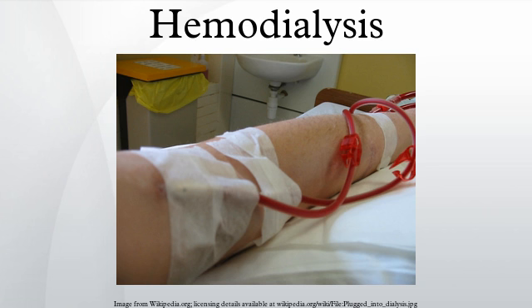If the pressure is removed prematurely or a patient engages in physical activity too soon after dialysis, the needle holes can open up. To prevent damage to the fistula and aneurysm or pseudoaneurysm formation, it is recommended that the needle be inserted at different points in a rotating fashion. Another approach is to cannulate the fistula with a blunted needle, in exactly the same place. This is called a buttonhole approach. Often 2 or 3 buttonhole places are available on a given fistula. This also can prolong fistula life and help prevent damage to the fistula.